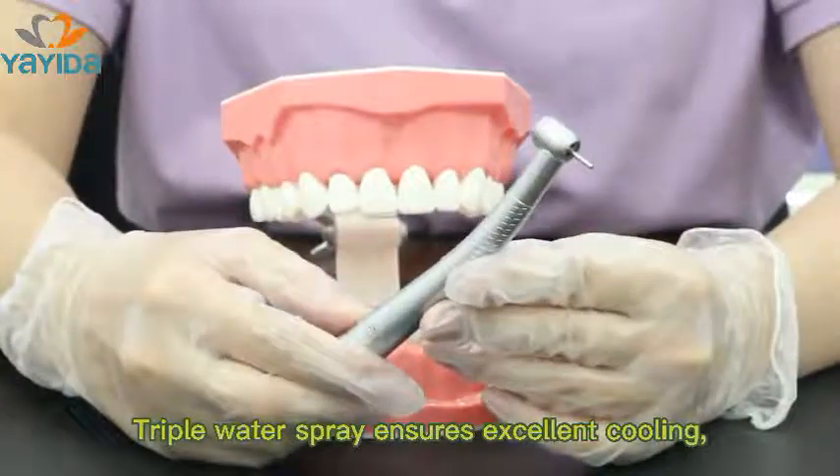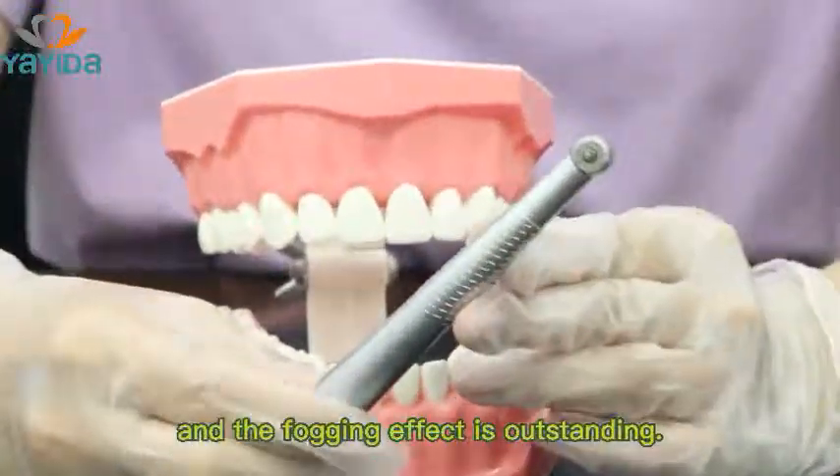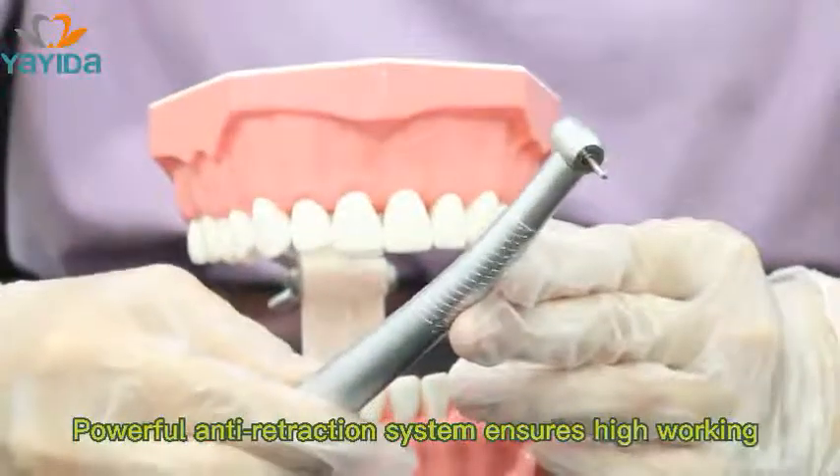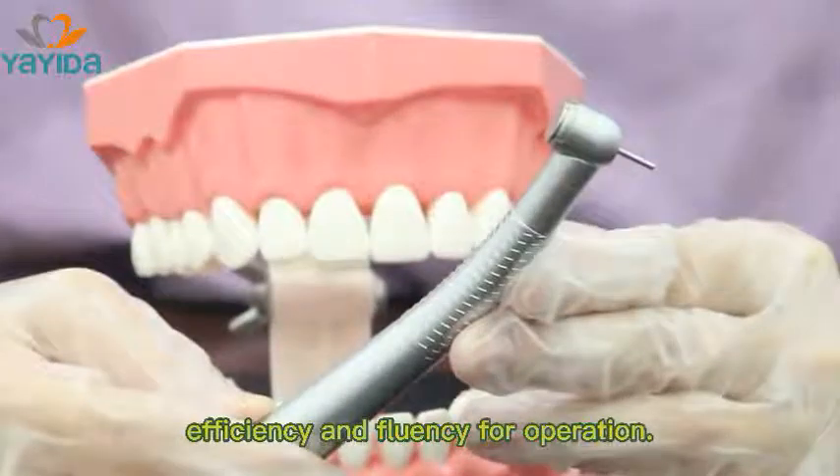Triple water spray ensures excellent cooling and the fogging effect is outstanding. The powerful anti-retraction system ensures high working efficiency and smooth operation.